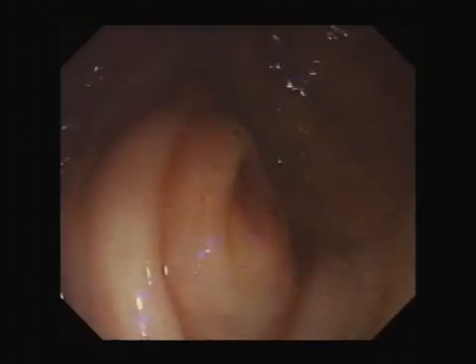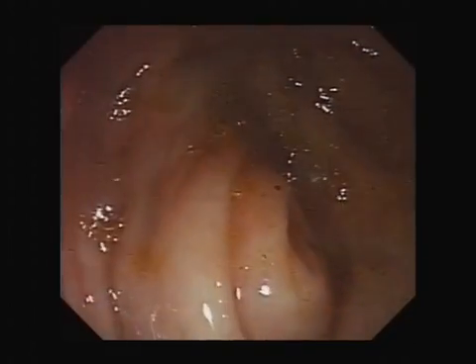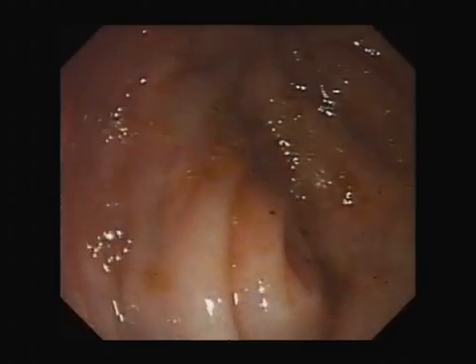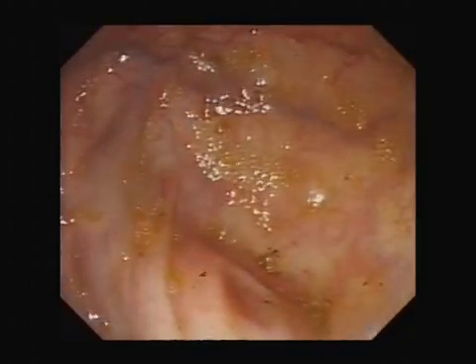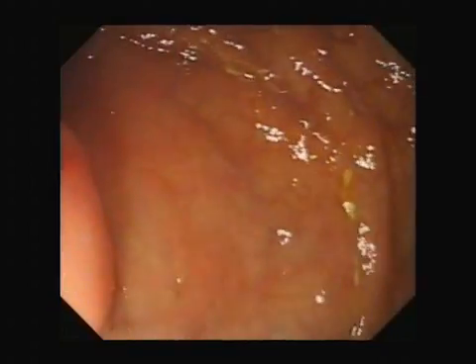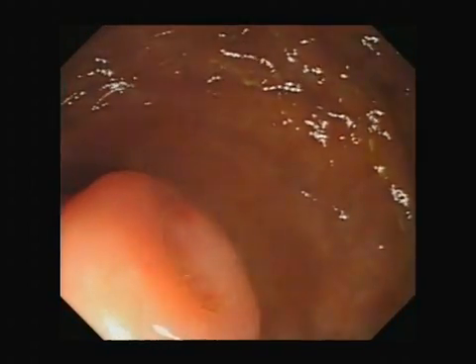The opening of the appendix can be a raised whorl like this. This inverted appendix stump shows its lumen.